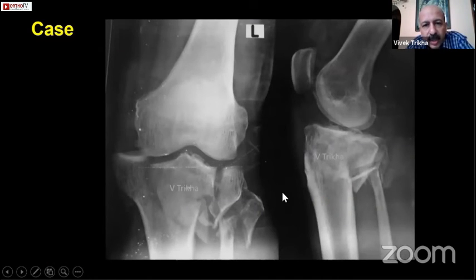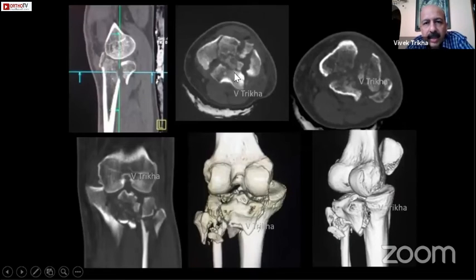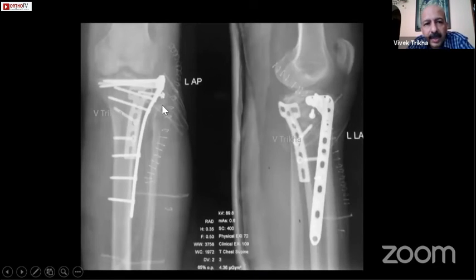Similar case of posterolateral as well as anterolateral side, you can see lots and lots of displacement. And these are very common nowadays when you see the CT scan, posterolateral and anterolateral side. How do you go about fixing them? Again, you can go through the fibula or through the Frosch approach and subsequently fix this from both an anterolateral plane and a posterolateral plane posterior to the fibula, without osteotomizing it, putting in both the fixations.